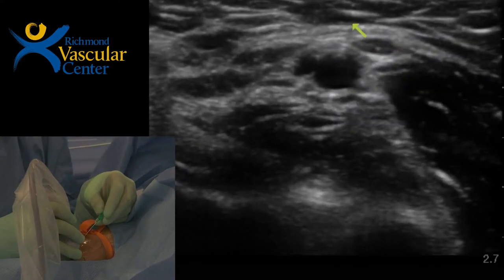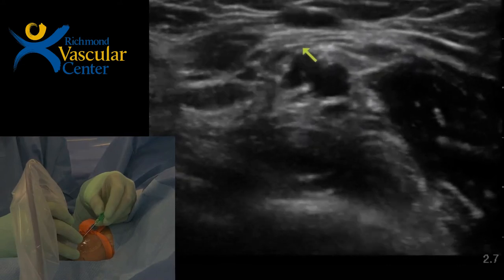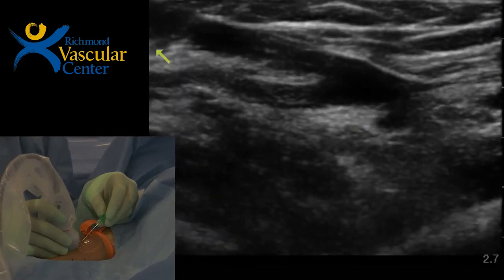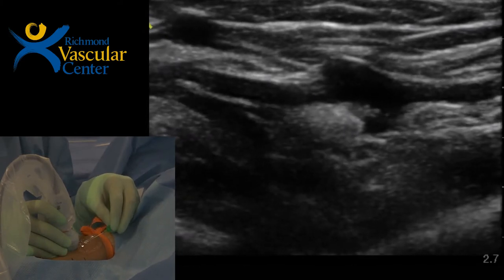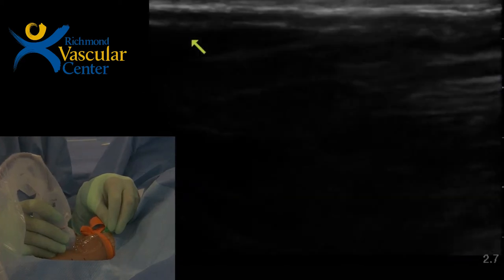So one of the tricky bits is finding the needle tip when you first start. It's real easy to get deep. See how deep that needle tip was? So it really needs to be up here more. And that looks a little more promising.